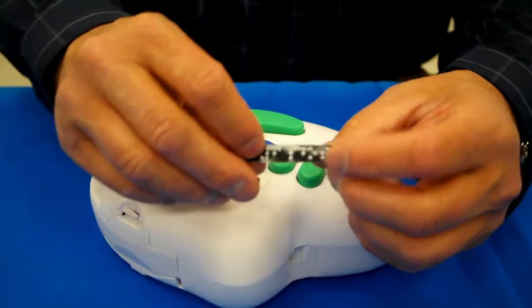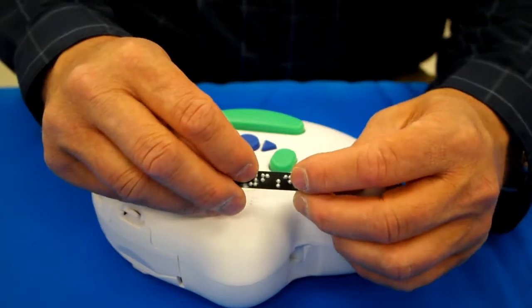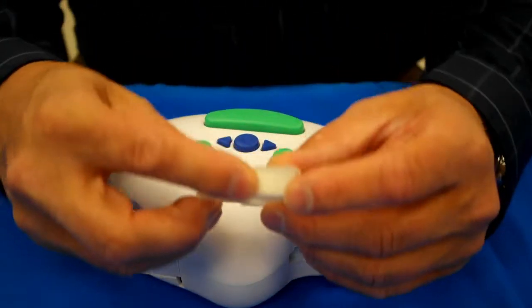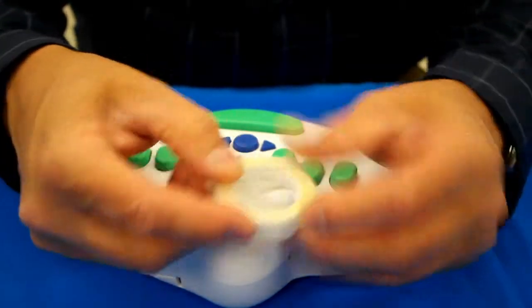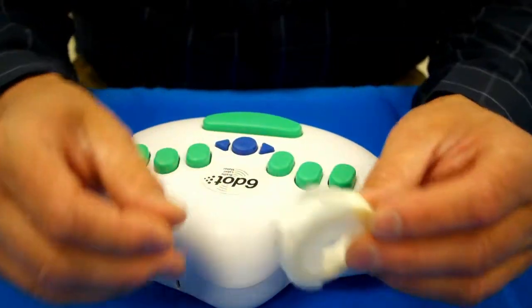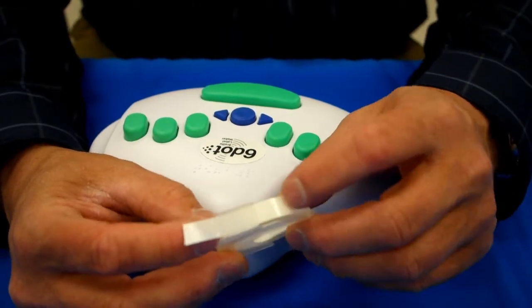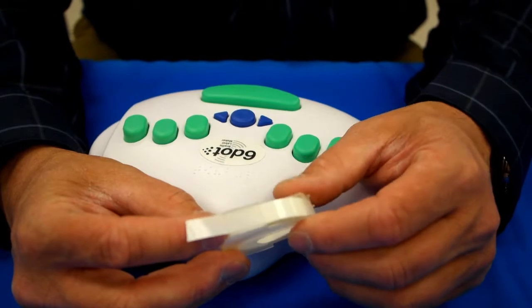We also have it available in colored tape as well as clear tape. The clear tape is really nice if you are going to be labeling where there's a sighted person who also needs to see what's behind the braille label, such as CD cases, medications, and cans of soup or vegetables.